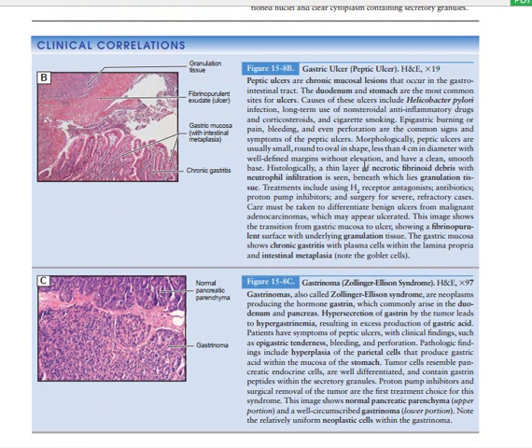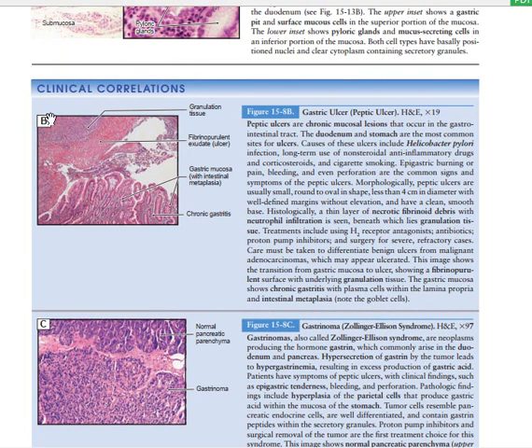So peptic ulcer is a chronic mucosal lesion, is it clear, which is mostly due to an infection from Helicobacter pylori or due to excessive exposure to anti-inflammatory products. Is it clear? So now this is the histologic section of a gastric ulcer. In histologic section of gastric ulcer, you're going to see many granulation tissues. One, you're going to see fibrinous or fibrinopurulent exudate of the ulcers.